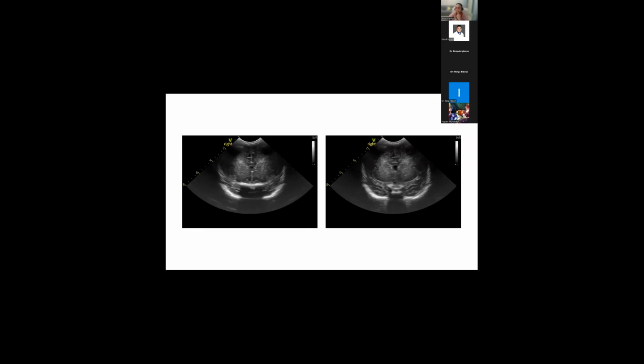Centralized properly? It's centralized properly. It's symmetrical, so I've got virtually 50% of the image on each side. But one of the things I would talk about is, can you see the depth? The depth is about 6 to 8 centimeters. So there's the option of us going in a little bit more.